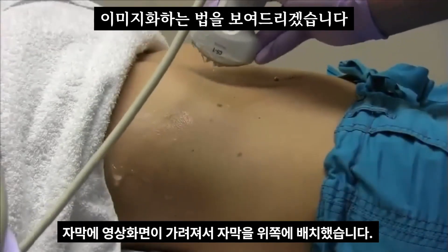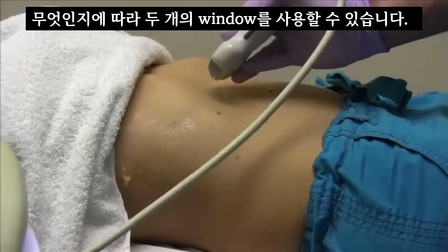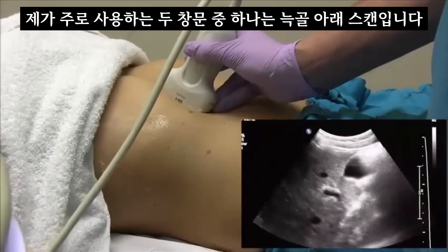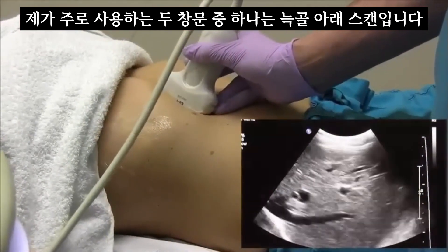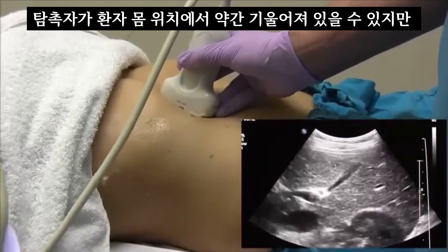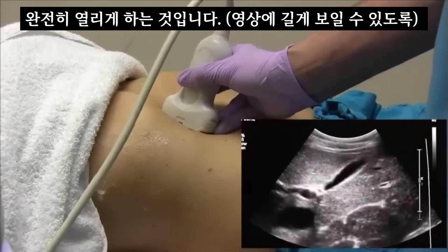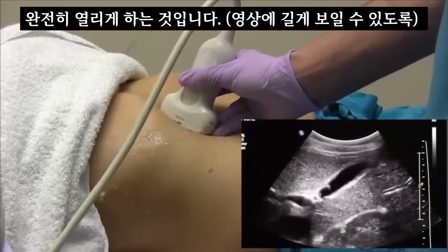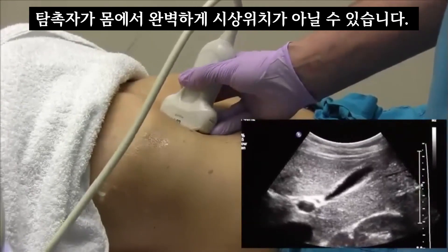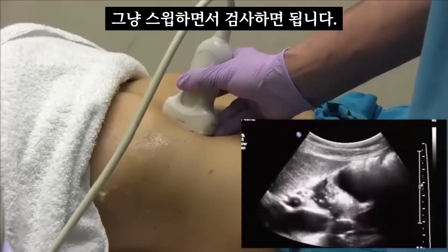Next we're going to show you how to image the gallbladder, and you can really use two windows depending on which one works best for the particular patient. One window I usually use is a subcostal window, and your probe may be slightly oblique to the patient's body. What you want to do is open up the gallbladder completely — you might not be perfectly sagittal to the body to get a sagittal gallbladder. From here, once you find that elongated gallbladder, you just sweep through.